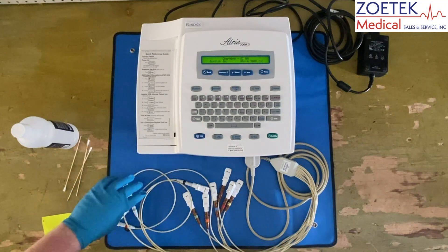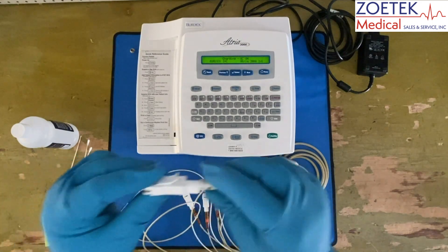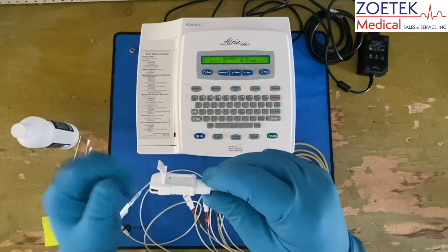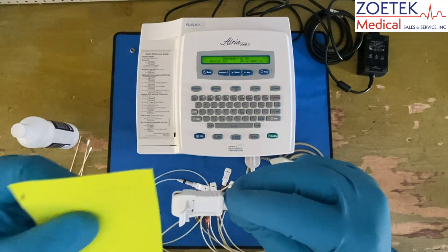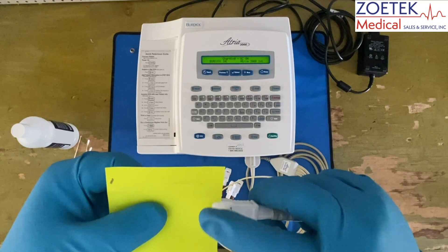The paper test is a simple way to confirm the lead clip's integrity. Grab a piece of paper — in this case a post-it note. Open up the clip and close it onto the paper as shown. Pull the paper, making sure the connection is held.